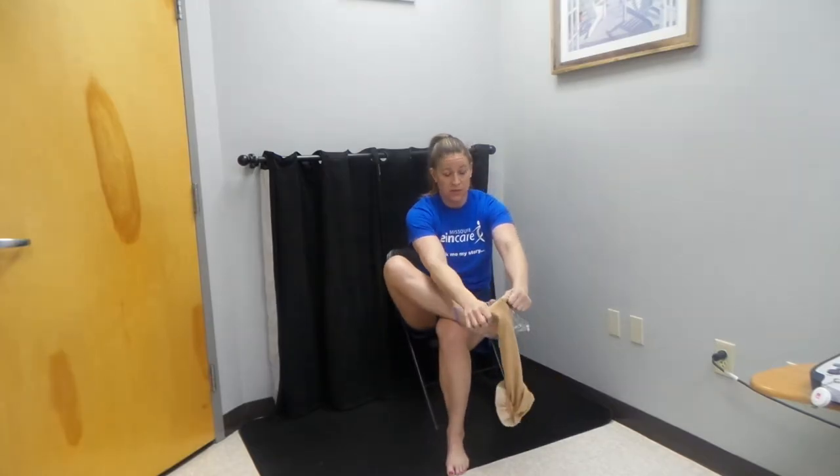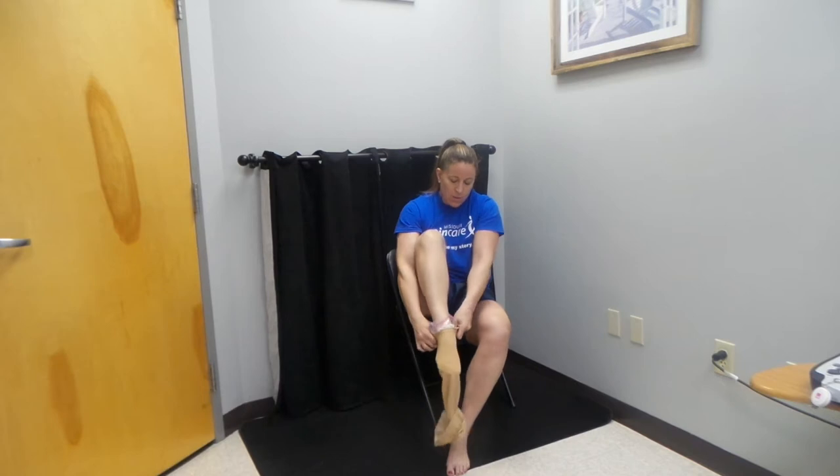Flexing the foot, we're going to pull the stocking over the toe and pull it over the heel. You're going to have to do a little bit of adjusting at some point in time, and that's okay.